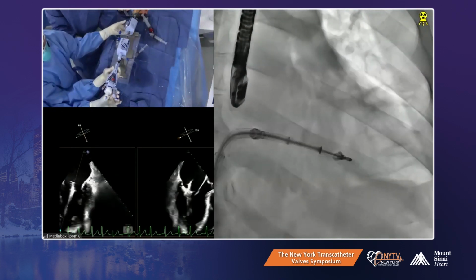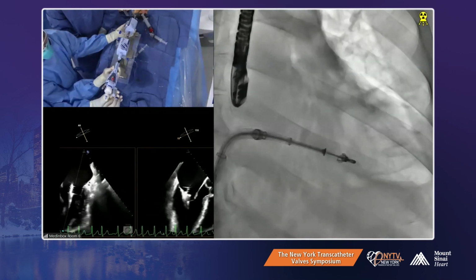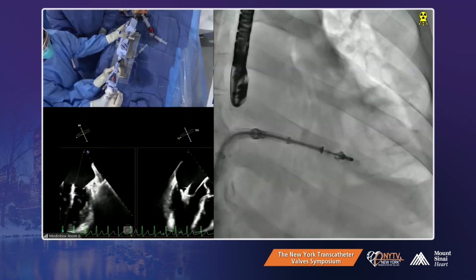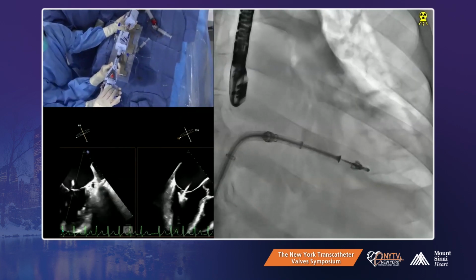Okay. Doing independent grasping, right? Which is okay. Okay, raise the posterior. Looking a little better. We'll get more posterior. There was a concern about how much posterior there was.